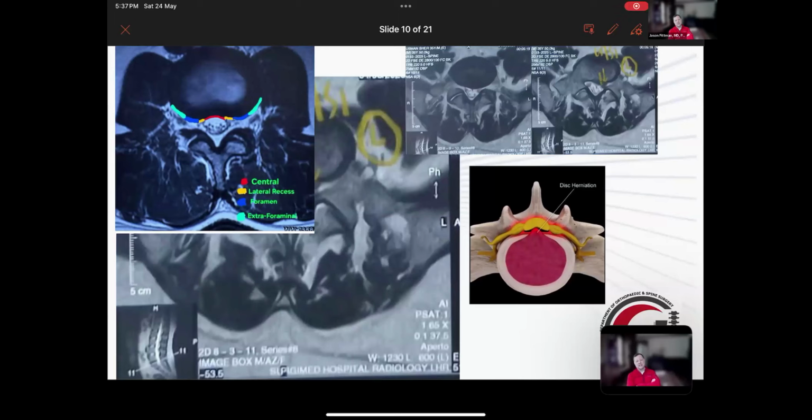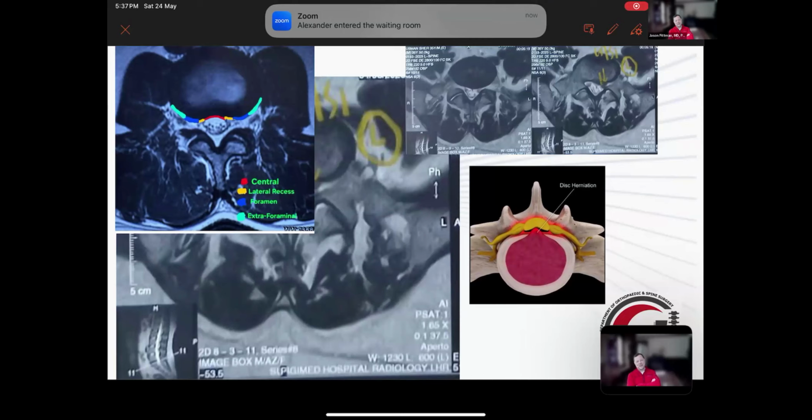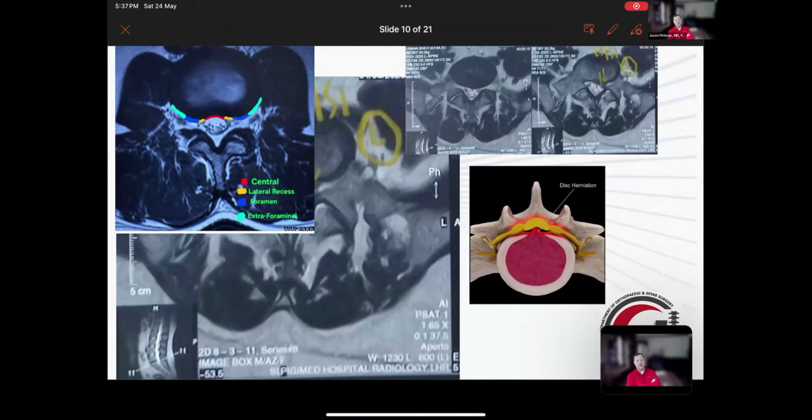And there's no difference in the irrigation between biportal and uniportal. So why are we placing drains in the biportal world other than a theoretical concern that hasn't really panned out? It's when you start, this is how I was taught, it's quote unquote the safest thing to do. And then people get far enough along in their experience and their exposure to the technique, they go, why am I wasting my time?